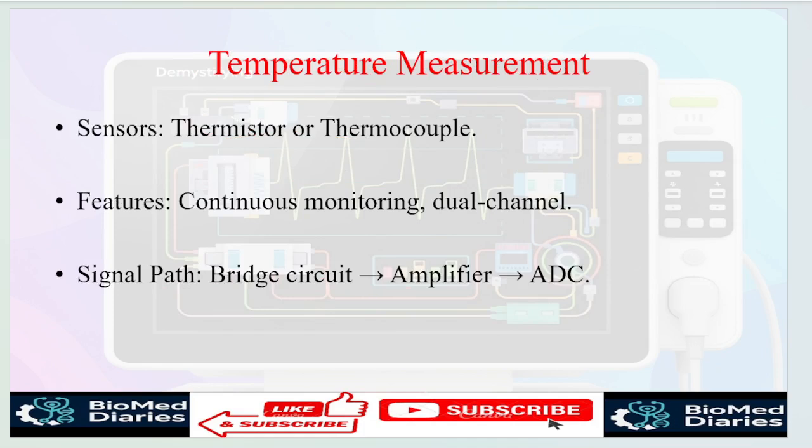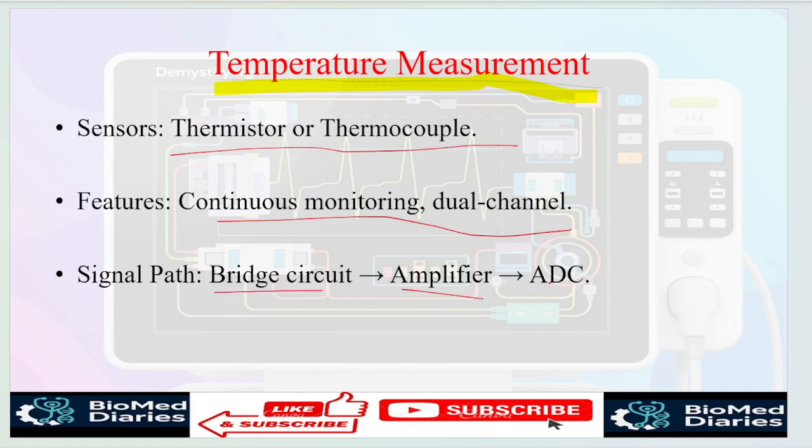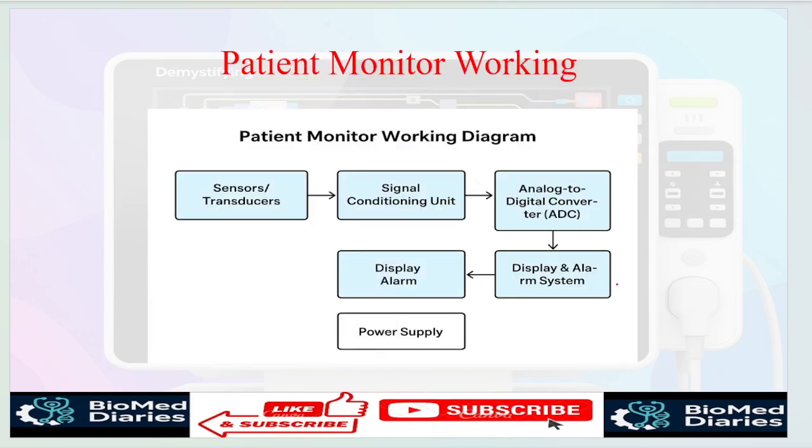Temperature measurement is also another parameter used in the patient monitor. The sensors used are thermistor or thermocouple. Features are continuous monitoring or dual channel. The signal pathway for temperature measurement is a bridge circuit, followed by an amplifier and analog to digital converter. So this is how the block diagram of the patient monitor works.